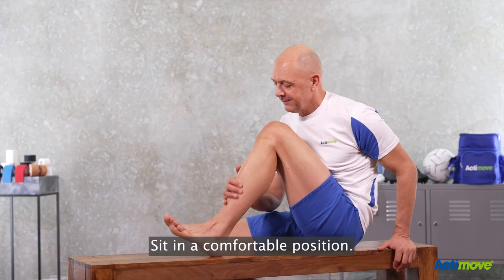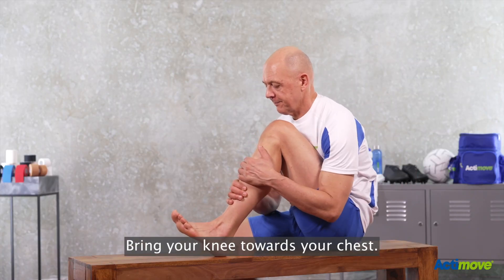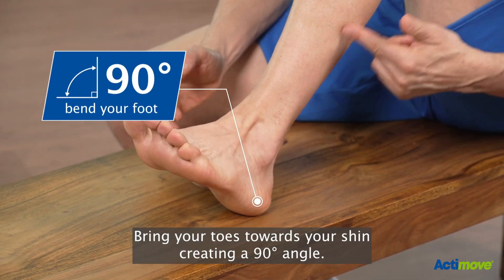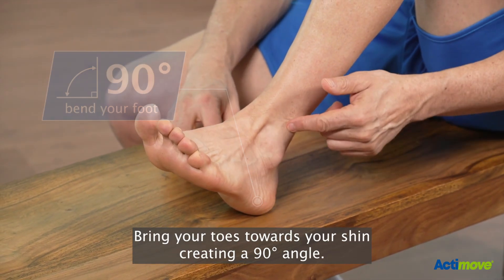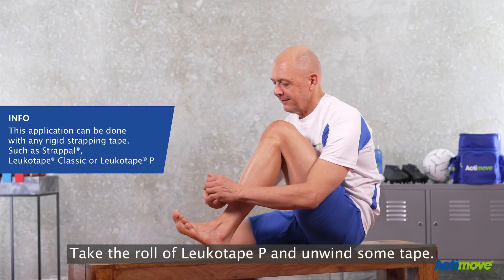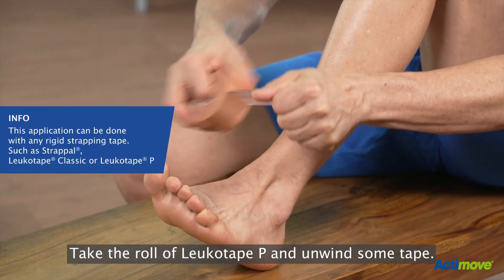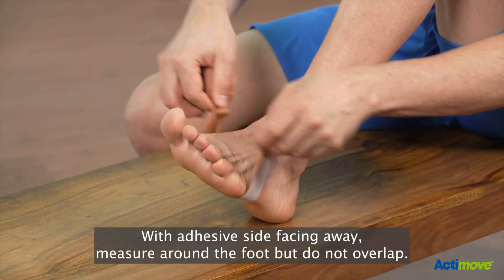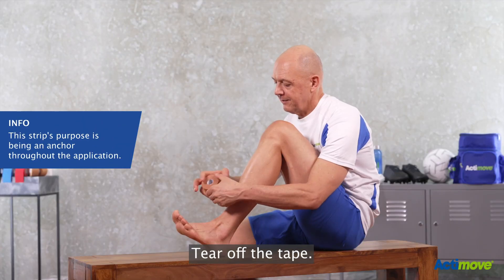Sit in a comfortable position, bring your knee towards your chest, bring your toes towards your shin creating a 90-degree angle. Take the roll of Leukotape and unwind some tape with the adhesive side facing away. Measure around the foot but do not overlap, then tear off the tape.